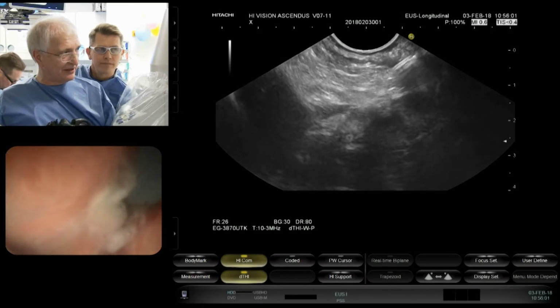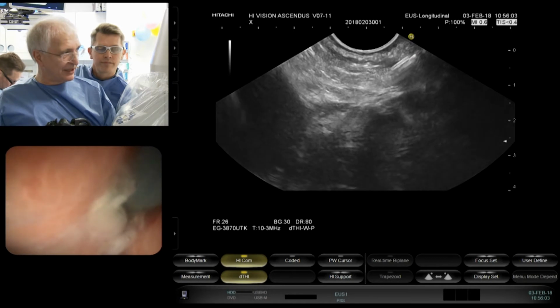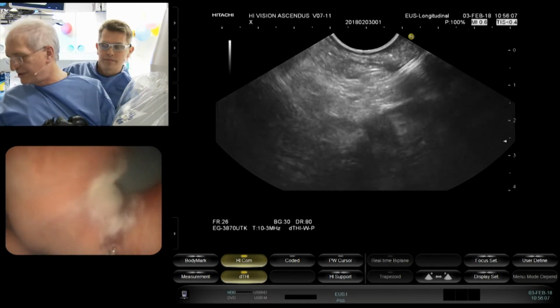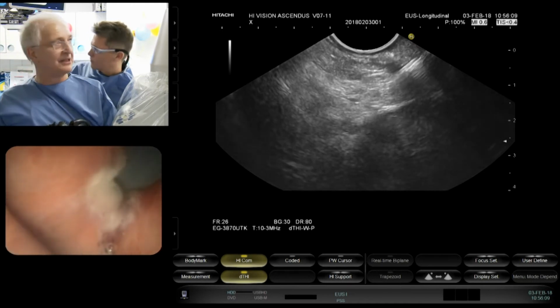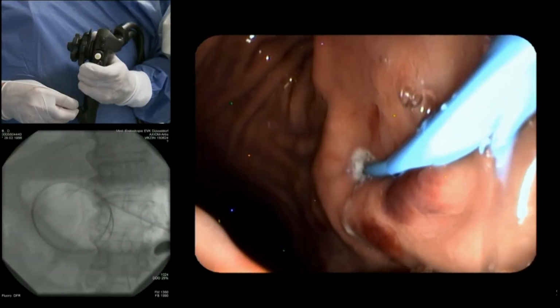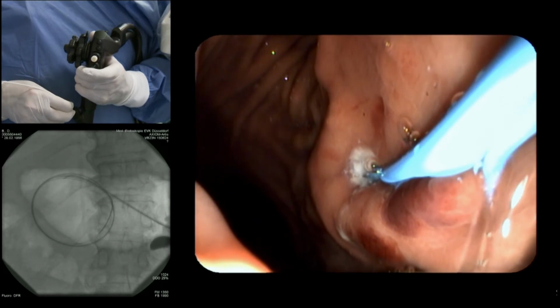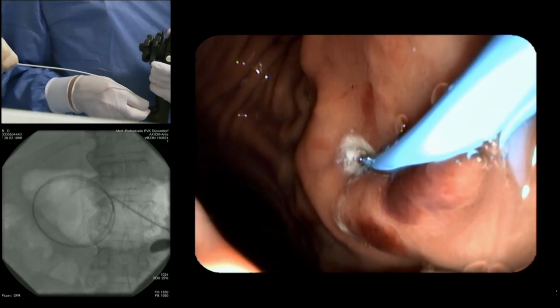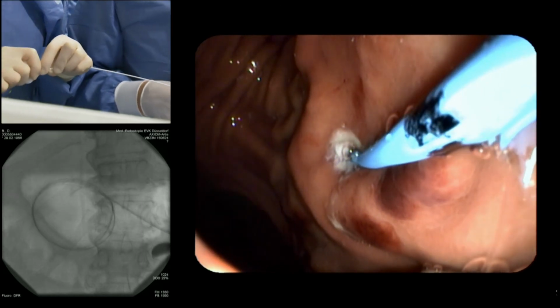This is a jag wire. Yeah. So you can push the wire, make a turn. Then we will be completely on the safe side. We have a stent which is already placed on the second wire. And I'm pushing very gently the stent up to the time I will see the black marker. You see that the distal pigtail is already inside. This is the distal marker.